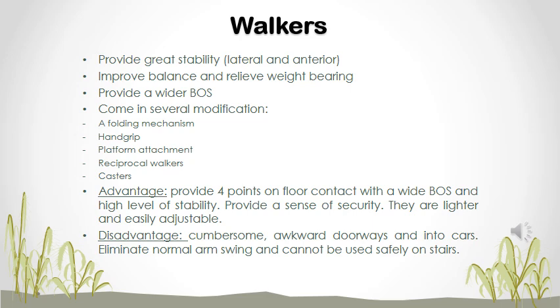Now we will cover walkers as another mobility aid. It provides great stability, lateral and anteriorly. It improves the balance and it also takes some weight bearing off injured or painful limbs. It provides a wider base of support and it comes in several modifications.